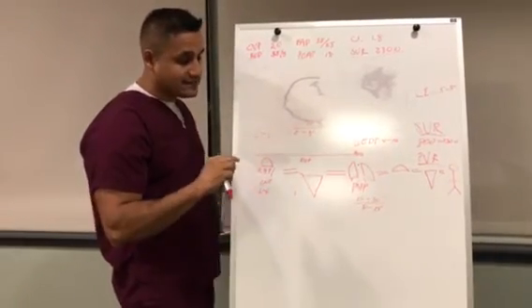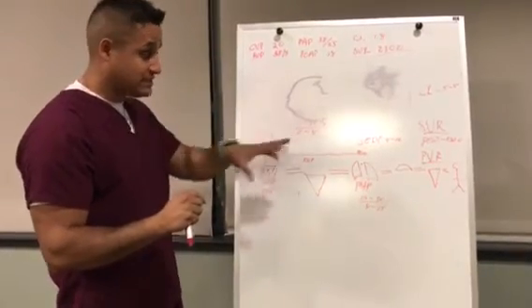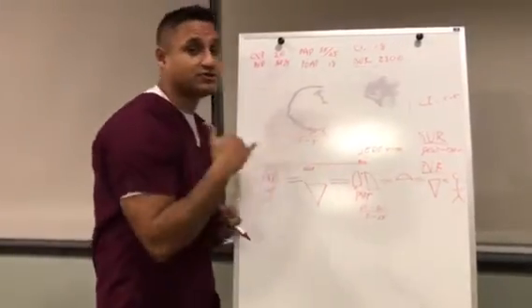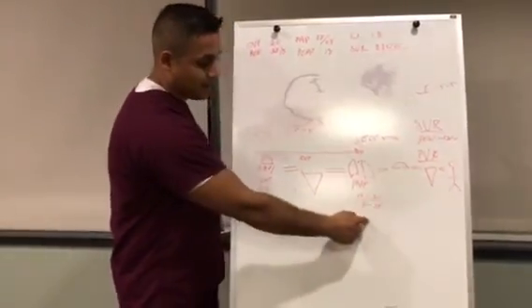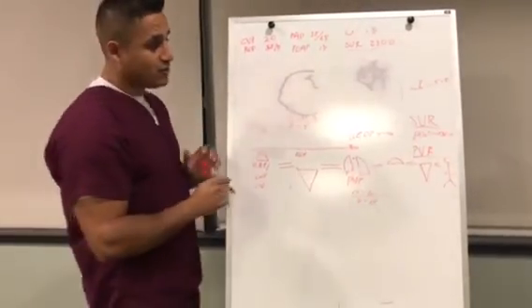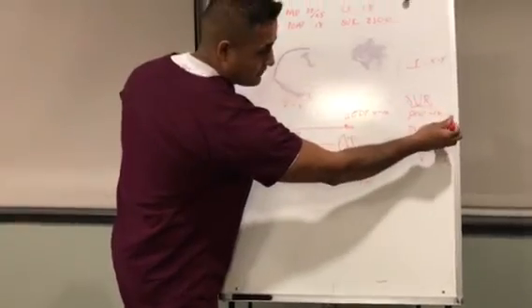So you have to look for trends, and this is how I came up with this little method that I use. You have to understand where in the system the pressure is increasing. If the pressure is increasing in the lungs, these two will be high, but not these two or the cardiac index. Does it make sense? So the systemic vascular resistance is here, okay?